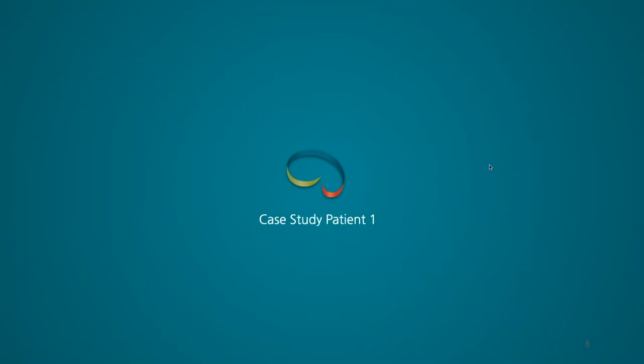Good afternoon, or good morning, depending on your location. So we've prepared a few cases for you this afternoon, and we think that they illustrate some different ways in which quantification of MRI imaging could help us in clinical practice.